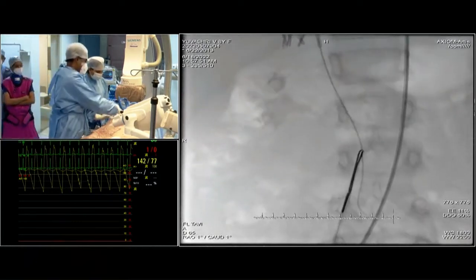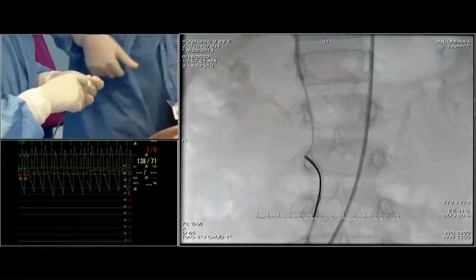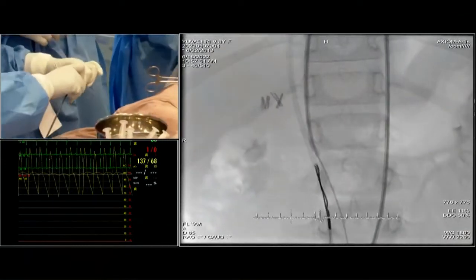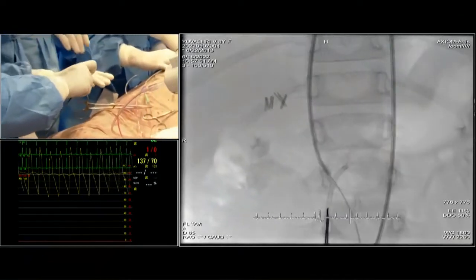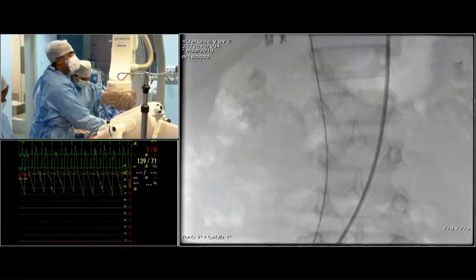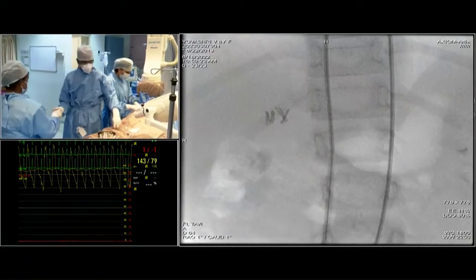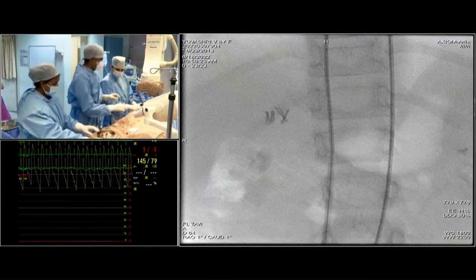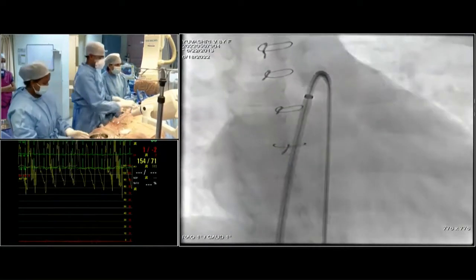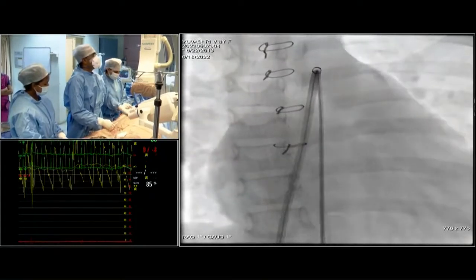I have with me Farine Qureshi, completing her second year, and Sister Salome who is threading the device. We need a long flexor sheath. You should use a braided sheath because it has to take multiple curves — a regular Mullins sheath will kink significantly.